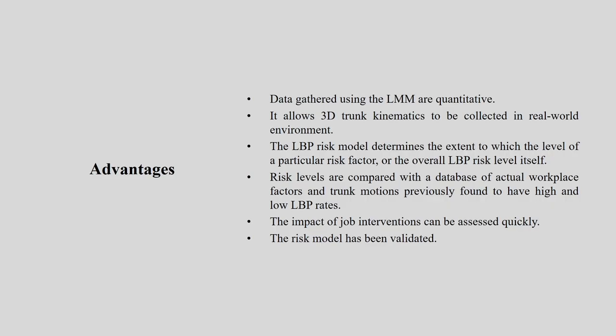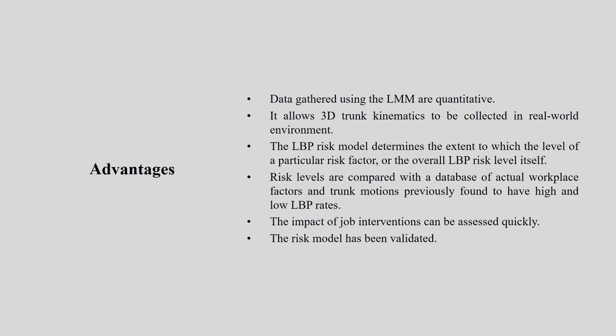Let us understand the advantages and disadvantages of this particular instrument. Data gathered using LMM are very quantitative in nature. So you have a lot of numerical values and a lot of scope to do a variety of statistical analyses using this type of data. It allows 3D trunk kinematics to be collected in a real world environment.